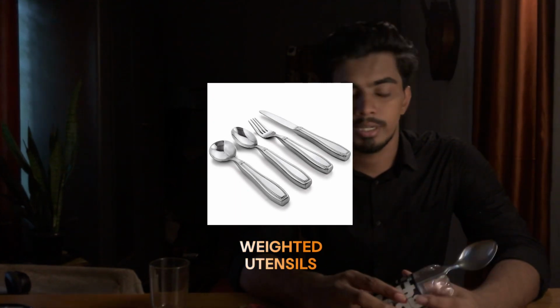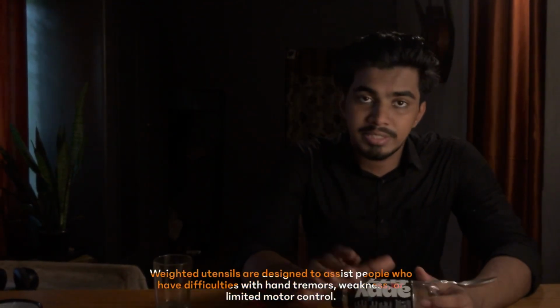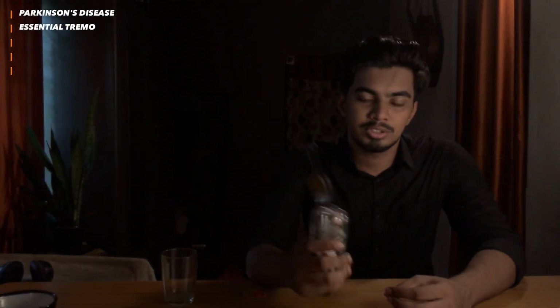Another popular adaptive device is something called a weighted spoon or a weighted utensil. With weighted spoons, it becomes easier for people suffering from conditions like Parkinson's disease to control the spoon or the utensil because now it has more weight. If you want to make that at your own home, you can make a similar build like this, and then you can just remove the cap and fill it with some water. If you need more weight, you can also use sand and small pebbles and stuff like that. So with that, you have transformed this built-up spoon into a weighted utensil. So those are two adaptive devices for eating.